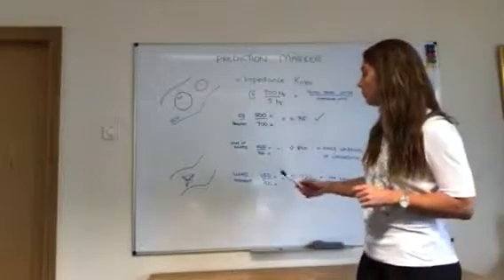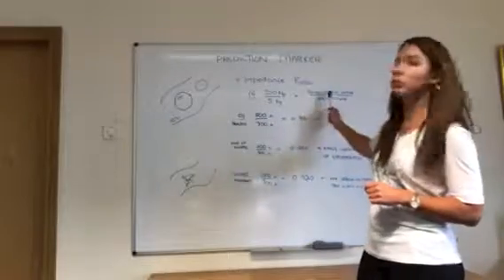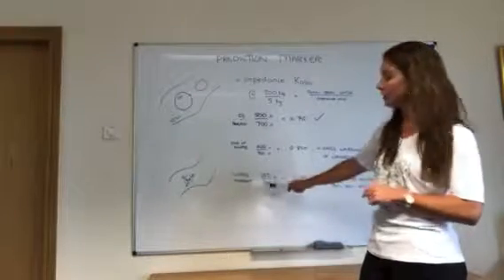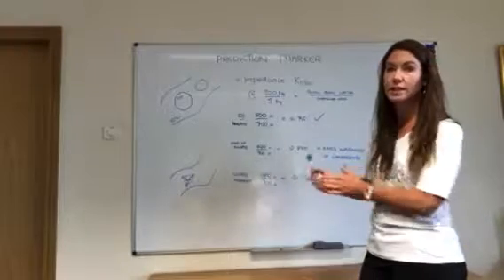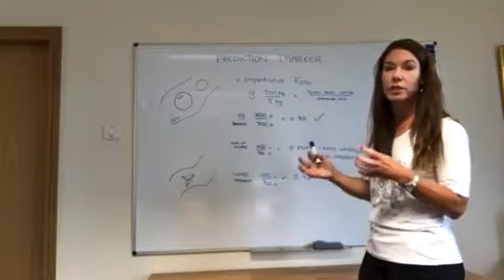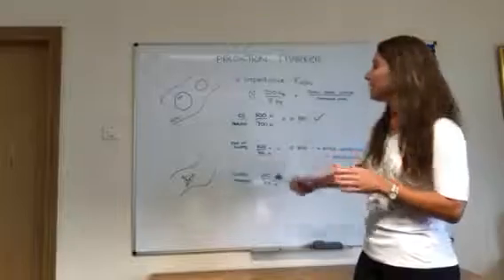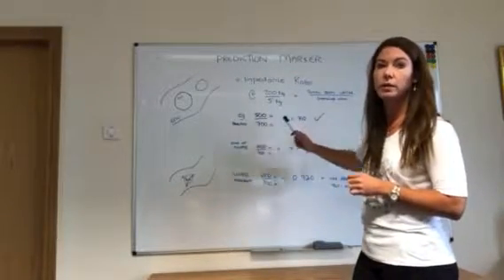The figures actually mean that at 200 kilohertz, that's your total body water. The difference between the total body water and your extracellular water is very little. So the maths work out between those two figures, the resistance at those frequencies is very little, which means the cell membranes are not creating a resistance as they did in the healthy cells, in the healthy person.